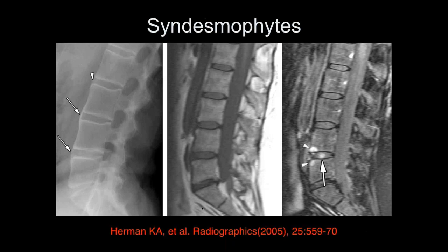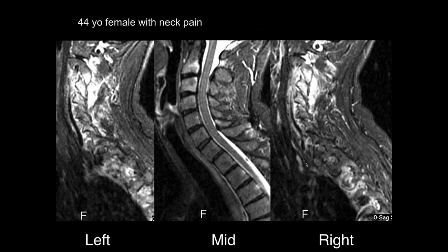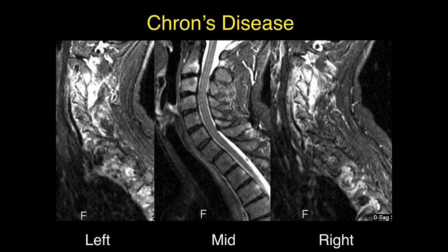44-year-old with neck pain. The facets have a lot of edema and there's also edema in the surrounding tissues and vertebral bodies at these levels. This could be an inflammatory arthropathy — and it turns out this is Crohn's disease. Inflammatory bowel disease falls in the same category in terms of the MR appearance of inflammatory lesions in the spine.